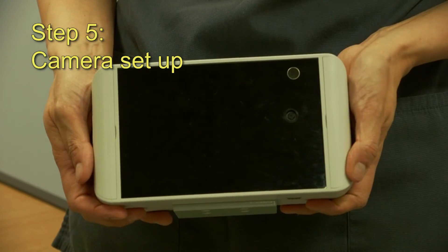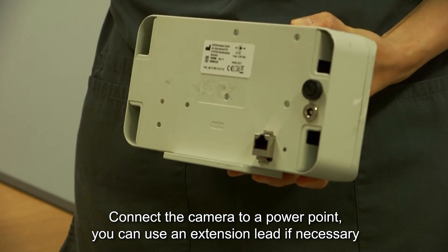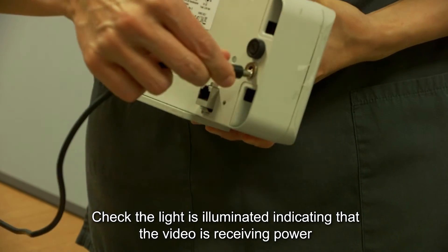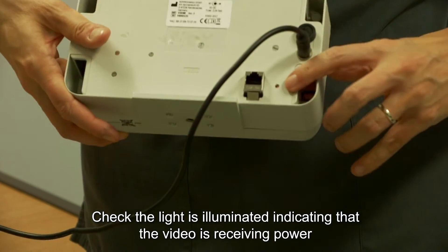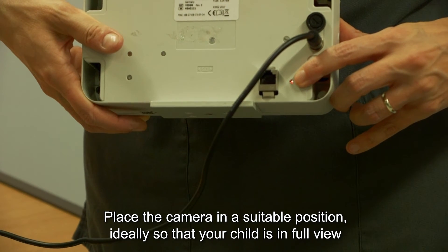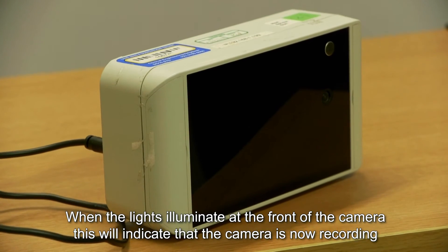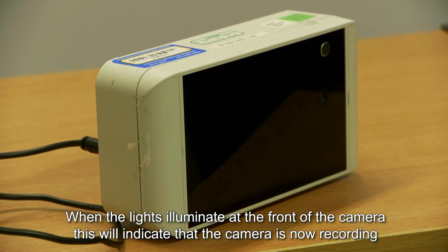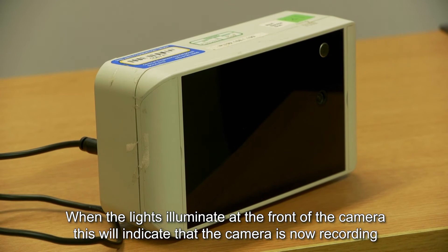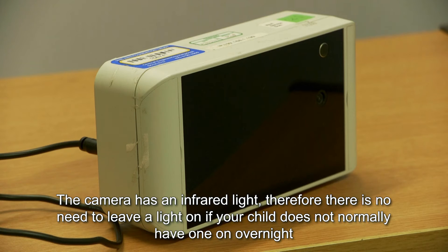Step 5: camera setup. Connect the camera to the power point — you can use an extension lead if necessary. Check that the light is illuminated, indicating that the camera is receiving power. Place the camera in a suitable position, ideally so that your child is in full view. When the lights illuminate at the front of the camera, this indicates that the camera is now recording — please do not unplug at this time. The camera has an infrared light, so there is no need to leave a light on if your child does not normally have one on overnight.